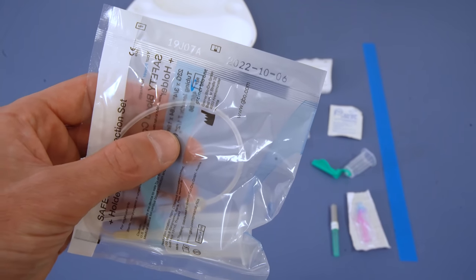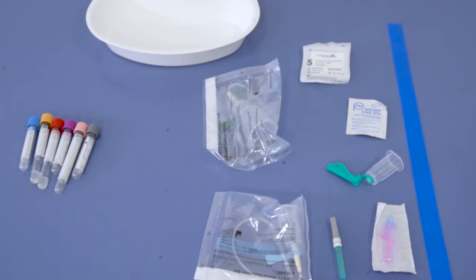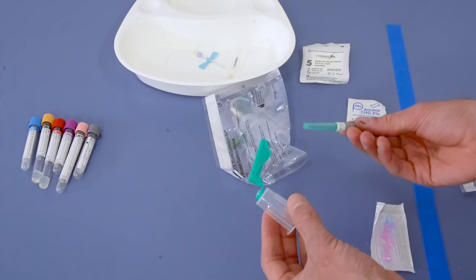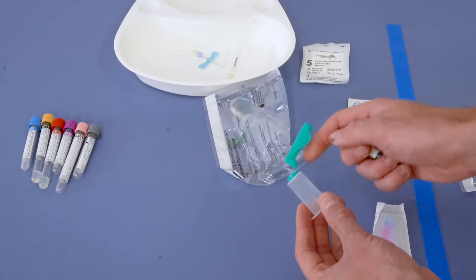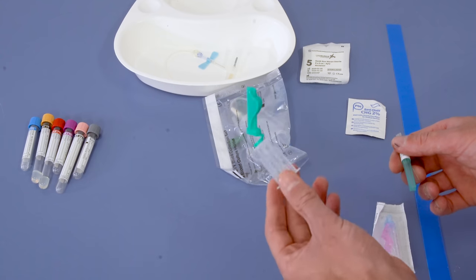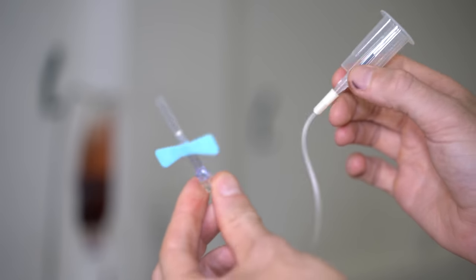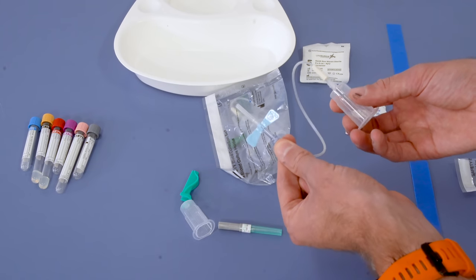When it comes to performing an invasive procedure on a patient, the number one thing is to check the expiry date of any kits you're using. Select the items that you want, prepare them, take them out of the bags, and have them all set when you're going into the room. Some situations you'll find a vacutainer receiver with a needle that has a nice safety cap — personally I'm a big fan of these as they allow you to be very fast and safe. We also have other sets, including a smaller gauge needle which allows more flexibility if you're trying to get into very small veins.